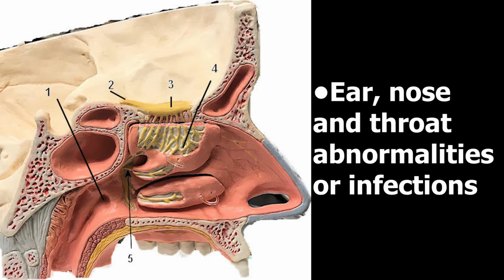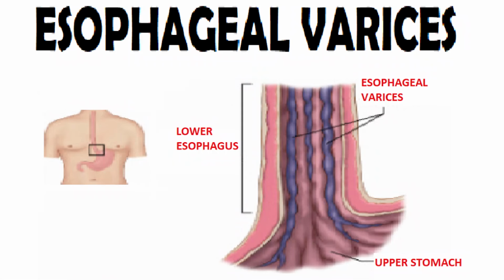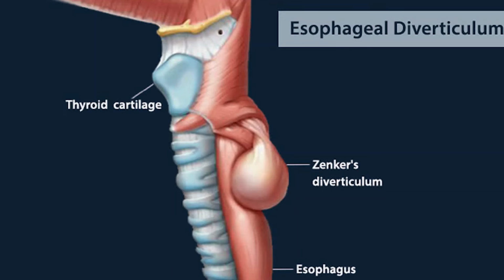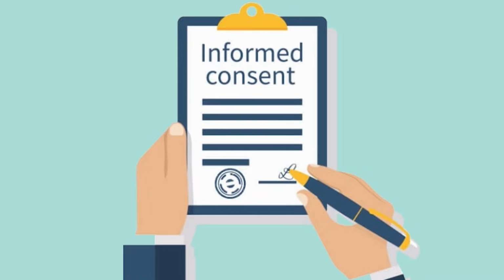In this procedure, you must take care of cases where there may be any ear, nose and throat abnormalities, or infection of these, or possible strictures of the esophagus, esophageal varices, anatomical abnormalities like esophageal diverticulae, or risk of aspiration, because due to the gag reflex there could be vomitus that could be aspirated, which could endanger the life of a patient. So before beginning the procedure, we need to explain it to the patient in patient-friendly language, and after explaining the whole procedure, you should gain consent to proceed with the nasogastric tube insertion.